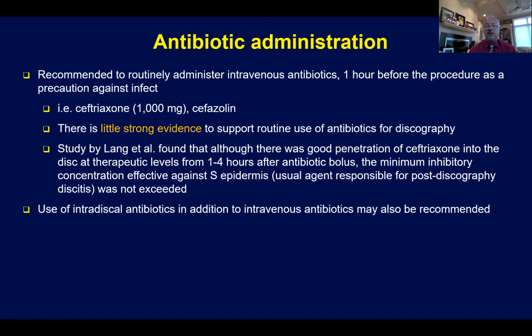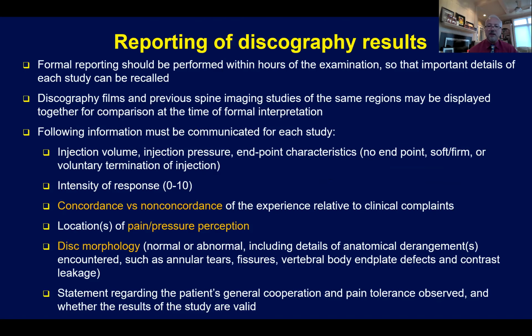Intradiscal antibiotics, again, may be utilized in small 5 milligrams per ml concentrations, for example. Now, after we've done the injection or during the injection, we rate the patient's pain immediately prior as well as during it, as well as immediately afterwards. So pain is an important endpoint. We're also looking for the volume. How much did we actually inject?